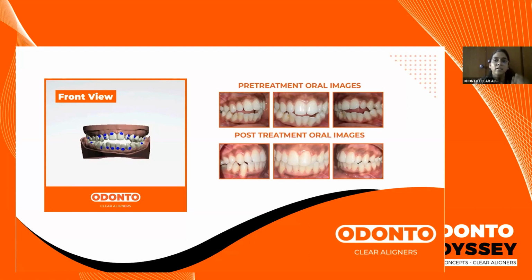That is like an added force that is placed for the bite to close effectively. Because there's a limitation as to how much an aligner can pull the teeth towards each other, which is why you will have the elastics which come into the picture. As well as you will see a few other attachments which will be present. They will be either, again, for retention purposes or to bring about a rotation correction also.